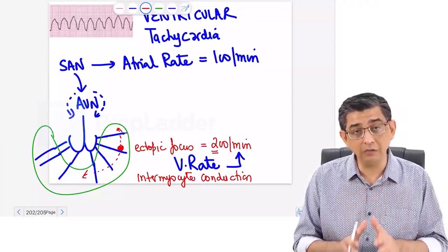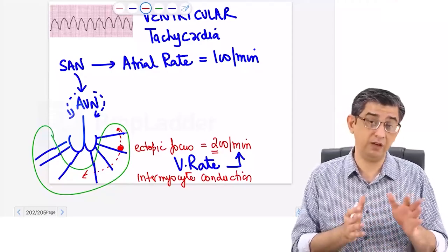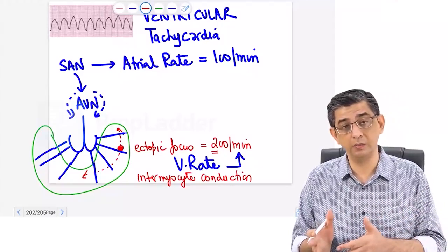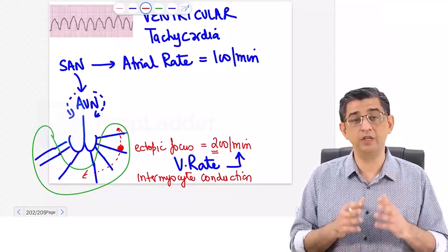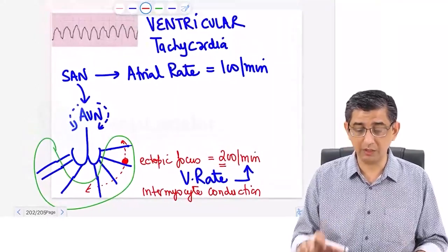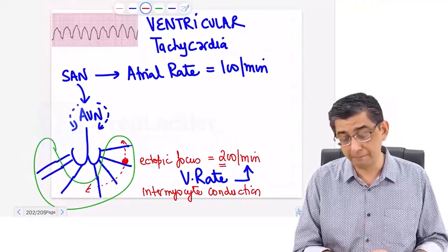It is the RR interval that will decide the heart rate of an individual, and tachycardias, which have a short RR interval, can either be narrow QRS complex or broad QRS complex. The logic is, if it is narrow QRS complex, it's mainly going to be a supraventricular tachycardia. Whereas whenever you read about broad QRS complex, which is the topic that I'm trying to explain to you at the moment, that is written as VT.